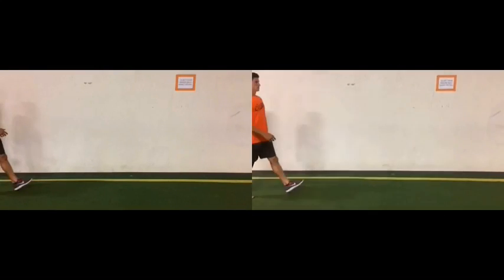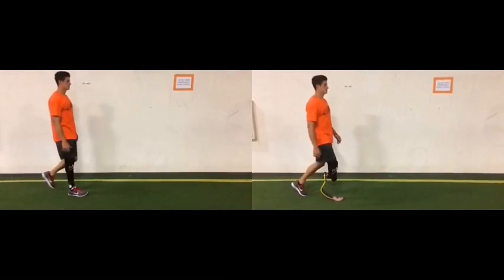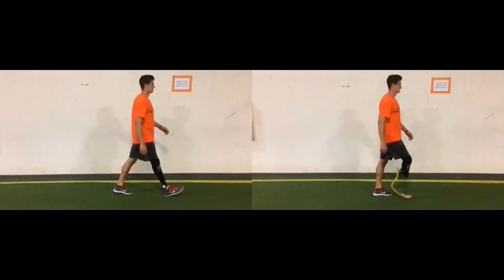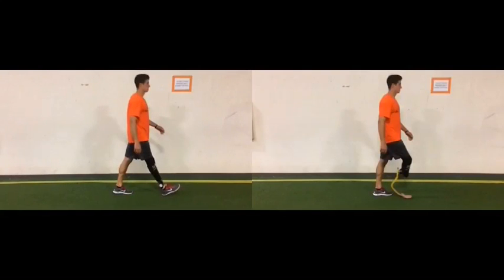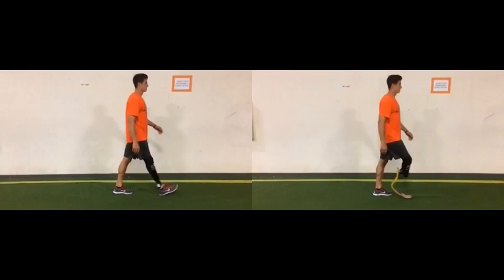Okay. Let's compare the two real quick. Watch the left screen and right screen, and watch the reference limb and the knee extension difference. I'm going to go ahead and pause it on this one. So we can see that this knee is pretty extended, almost hyperextended, going into initial contact and loading. And I believe this is to help load that heel up to get a nice rollover onto the toe.